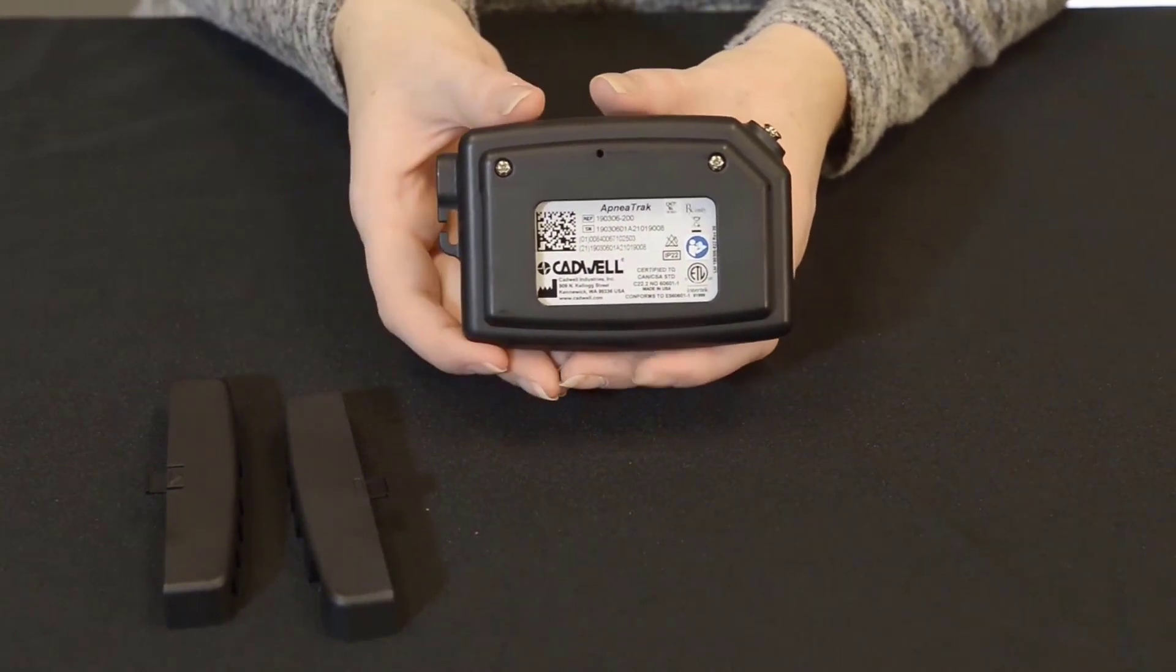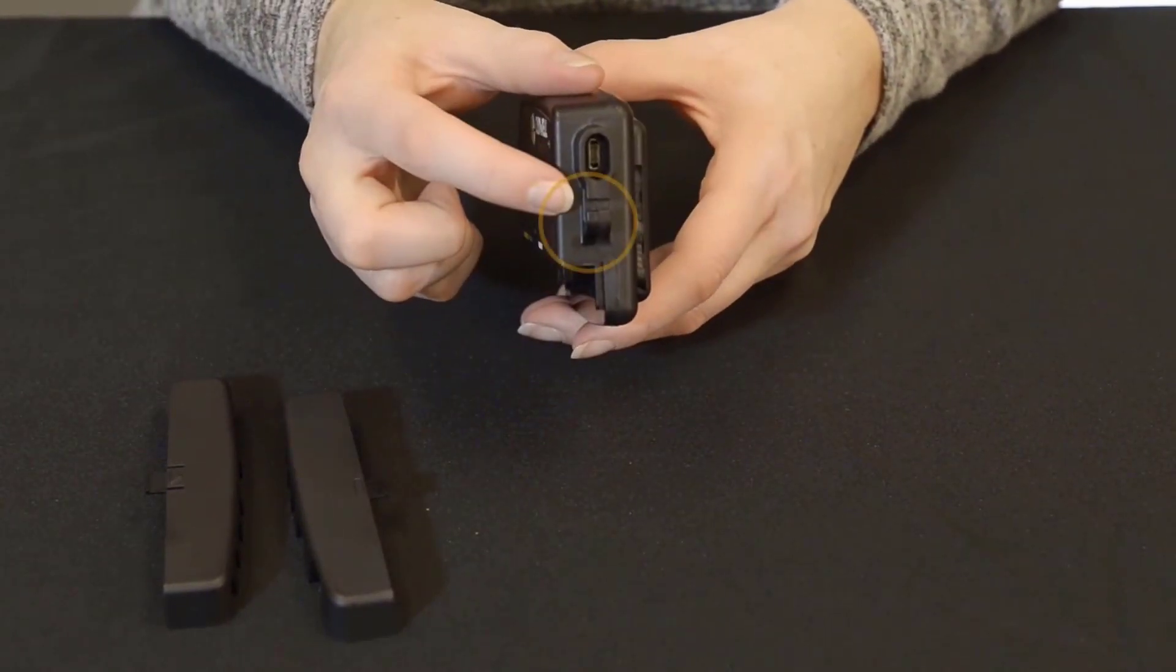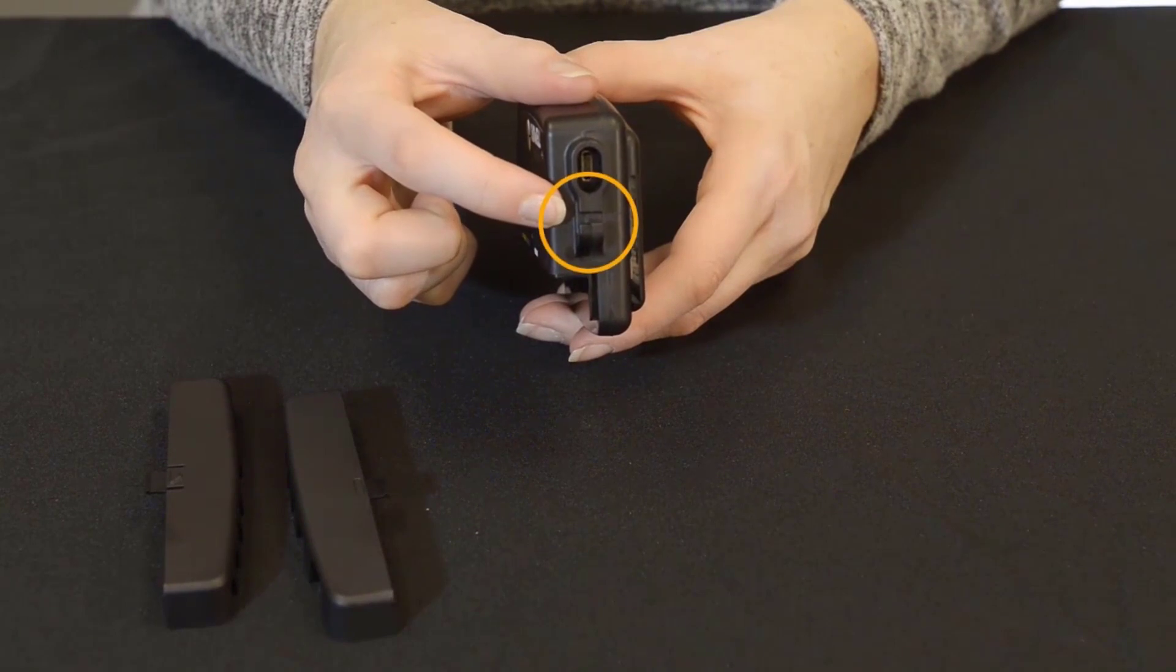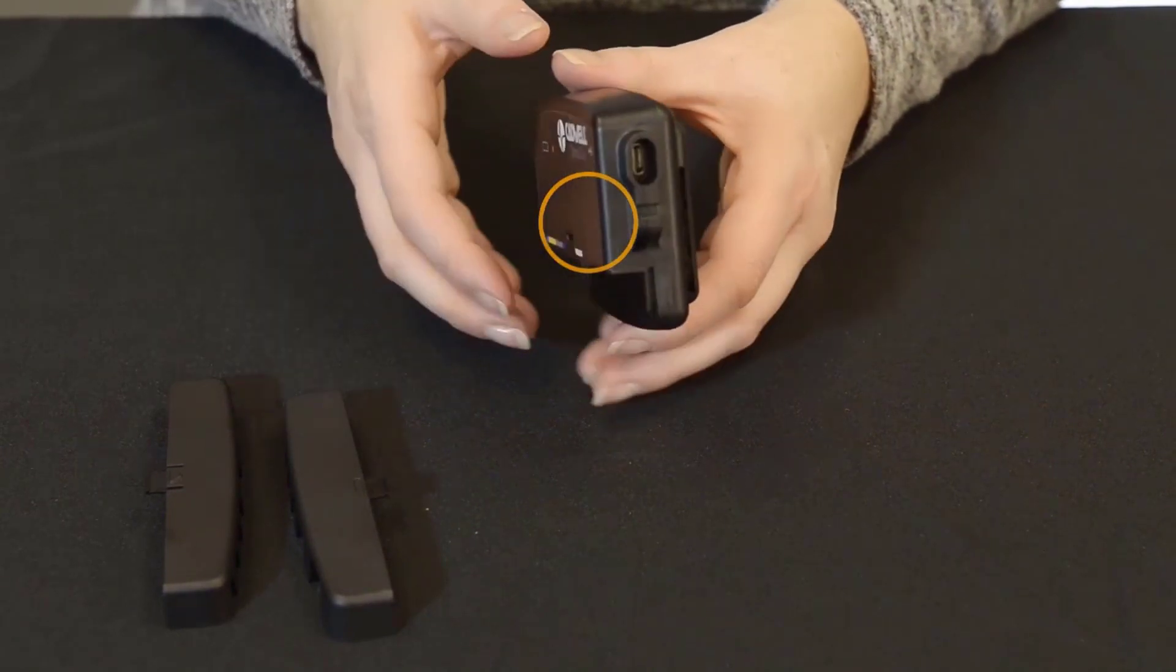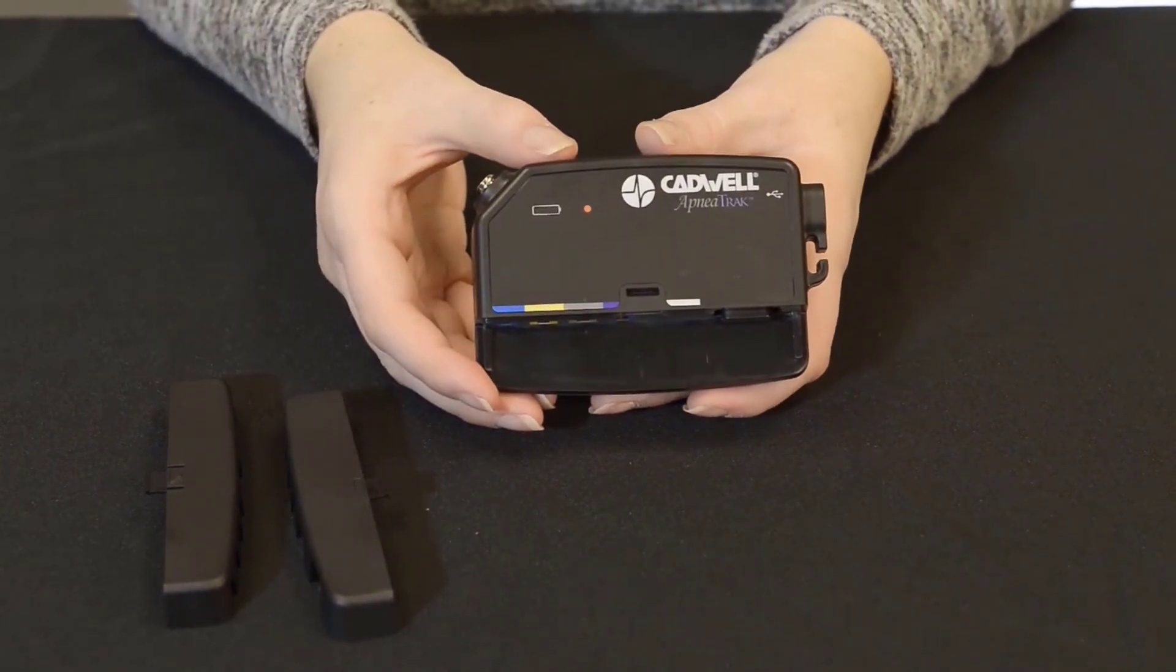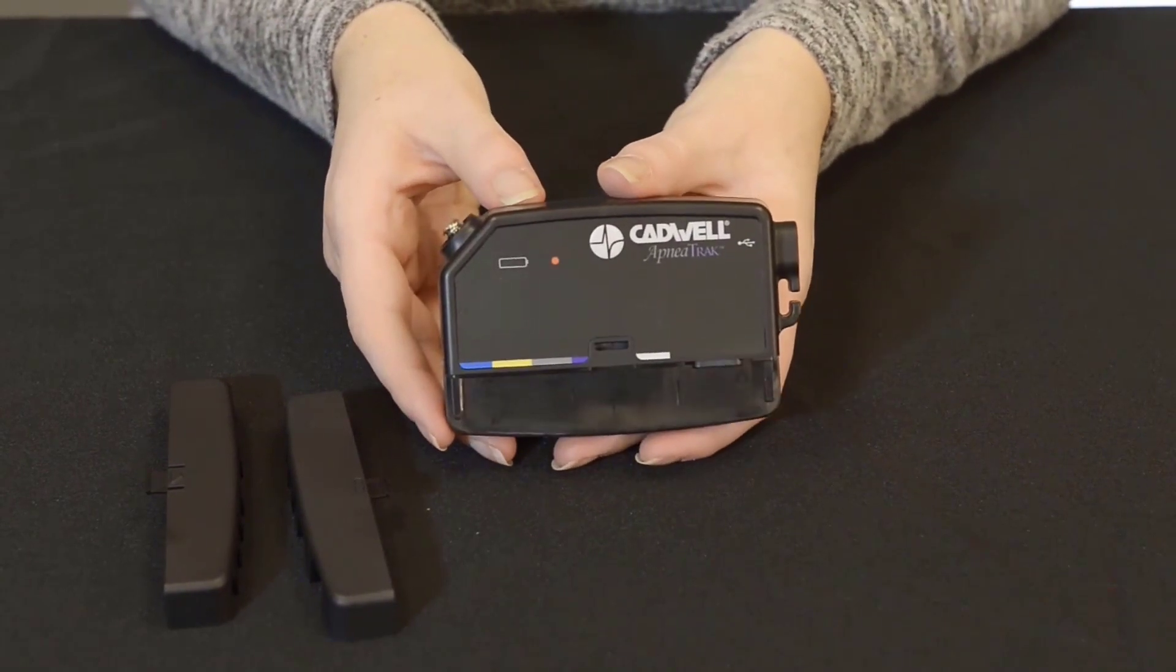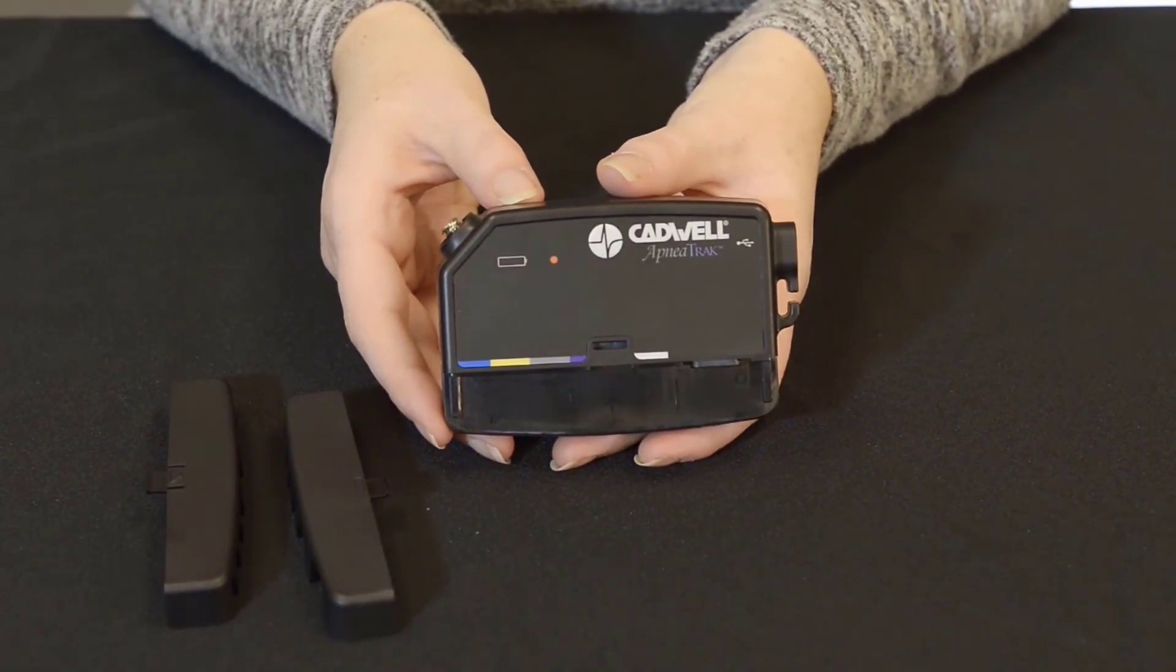Just below the USB-C charging port, you will find a strain relief hook. When connecting your oximeter to the device, you can press the cable into the hook to help prevent the oximeter from pulling out of the device during a study.